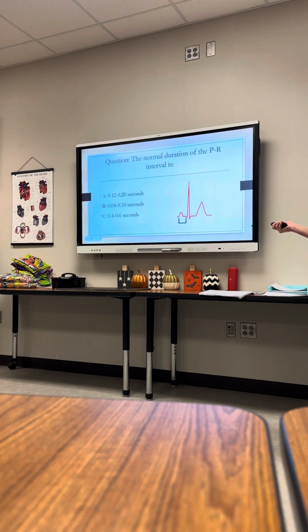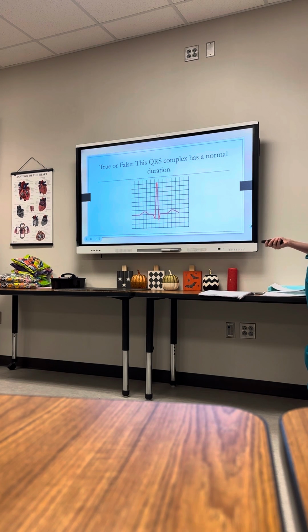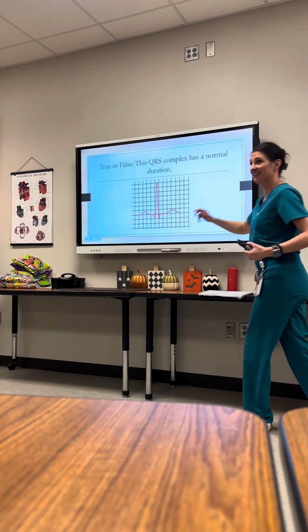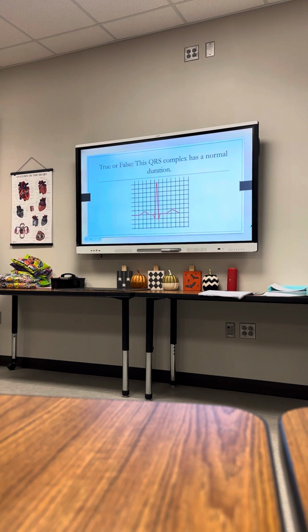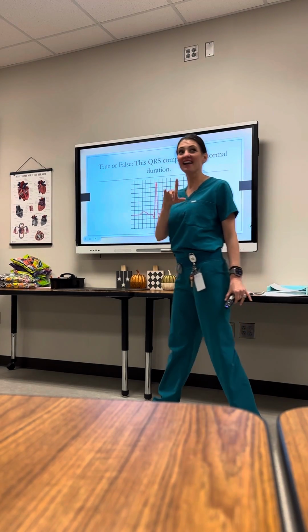All right, next question. True or false? This QRS complex has a normal duration. So think about what I told you was a normal duration for a QRS, and then take a look here. Y'all can do it. True or false? Is this a normal duration? This is what my last class did. Everybody was saying false, but this is actually true, y'all.